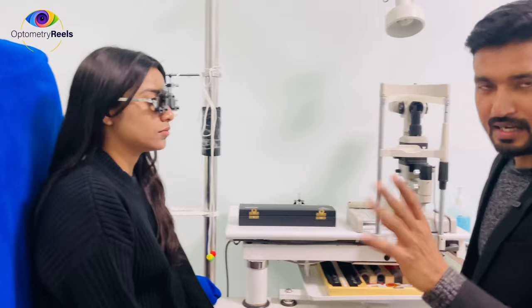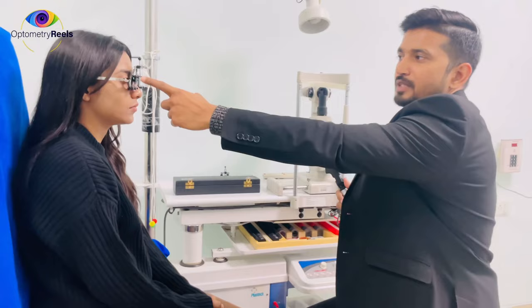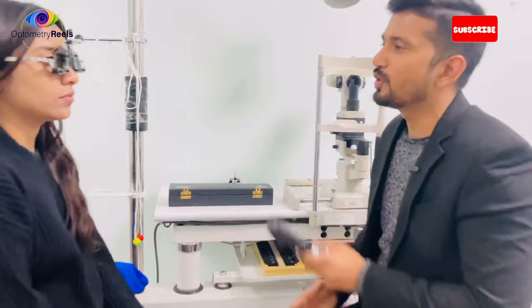A highly important point that many eye care practitioners get wrong is the technique. For the right eye, always start with the right eye: the retinoscope should be in your right hand, and use your right eye to scope the patient's right eye. Both eyes must be open. For the left eye, hold the retinoscope in the left hand and use your left eye.